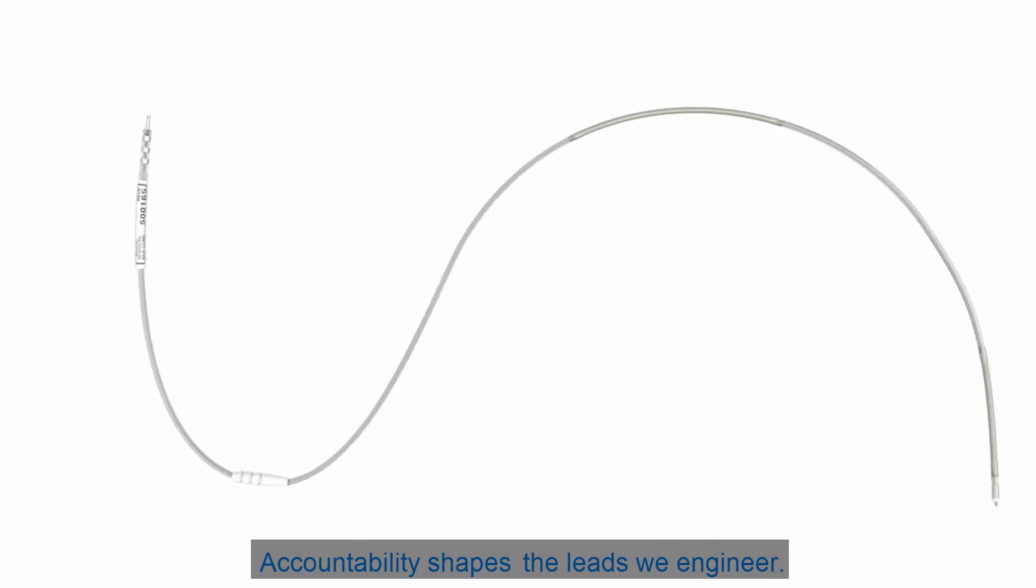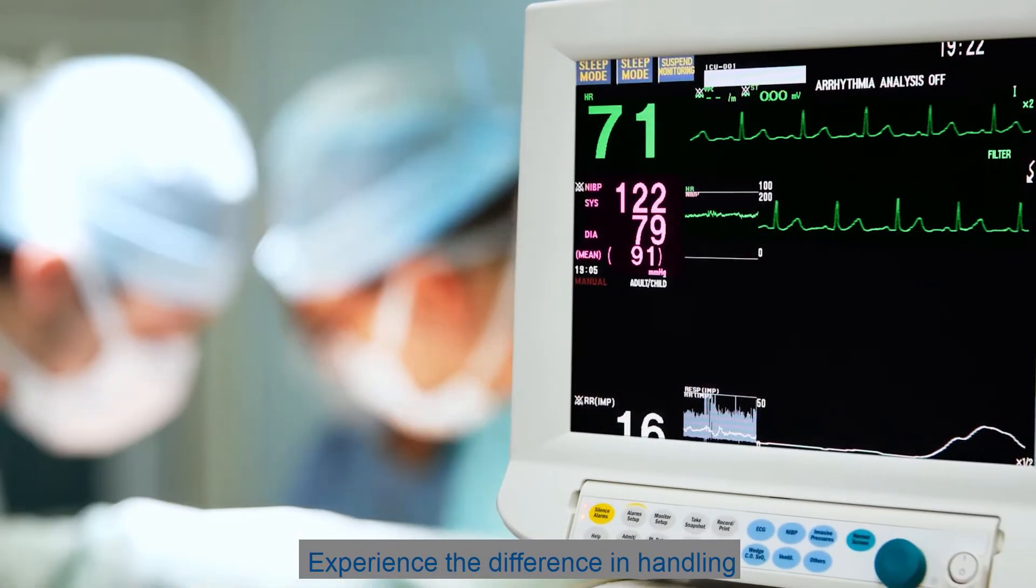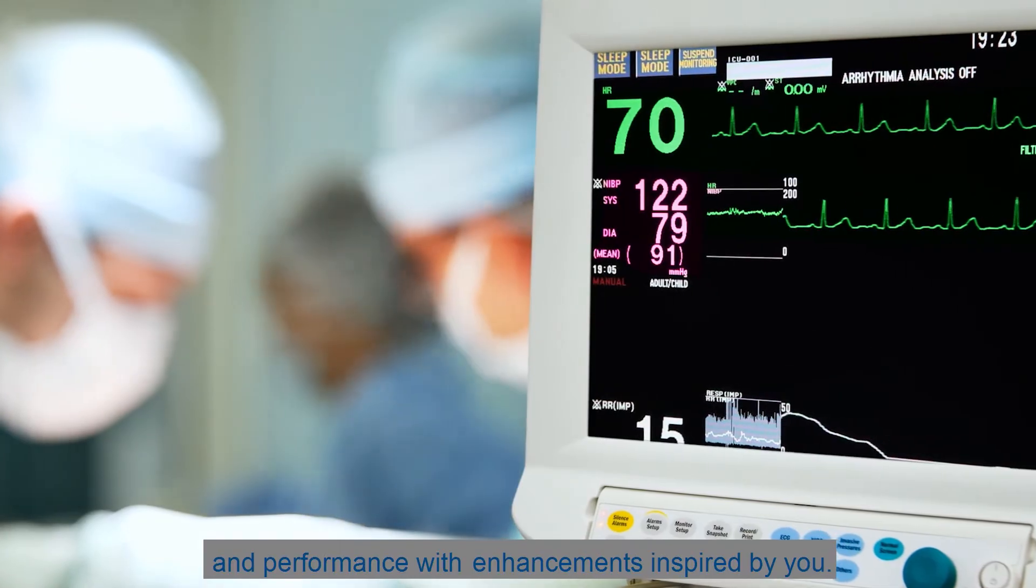Accountability shapes the leads we engineer. Experience the difference in handling and performance with enhancements inspired by you.